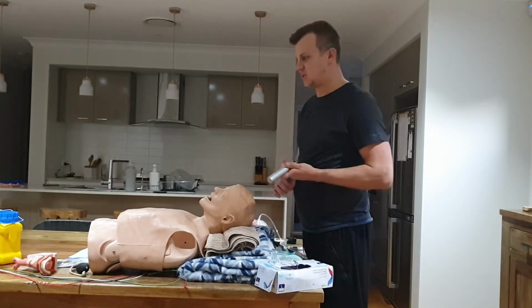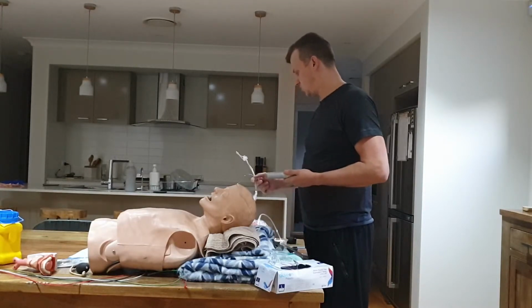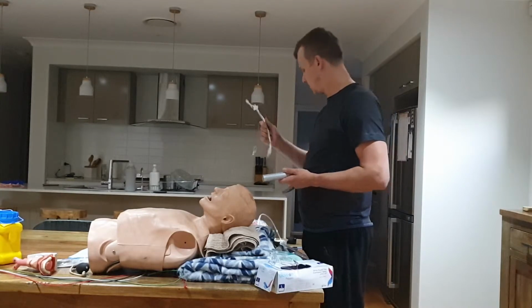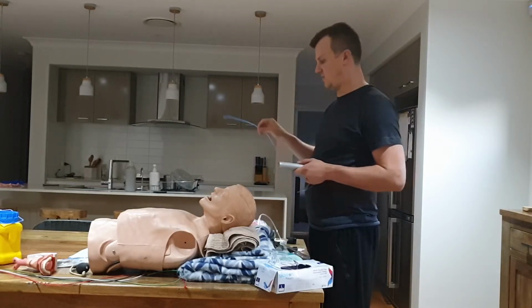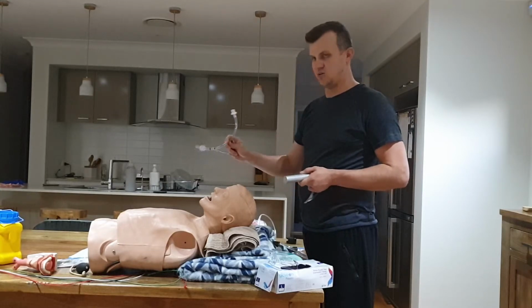So you'll normally have an assistant doing this. There's a couple of different methods we can use to insert a tube. We've got the stylet placed inside of an ET tube, which you can pass through and then pull the stylet out. You could use a bougie as well, feed that in first, and then feed the tube over the top. And also you can just insert the tube itself.